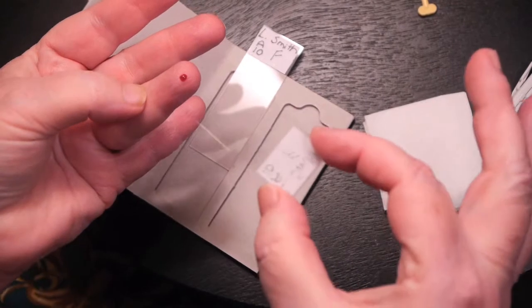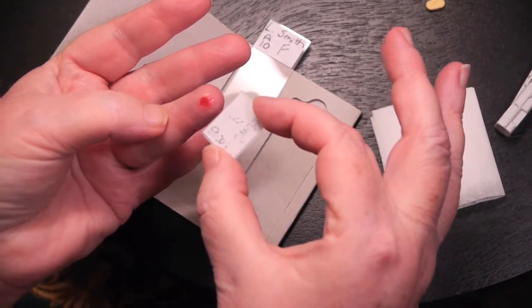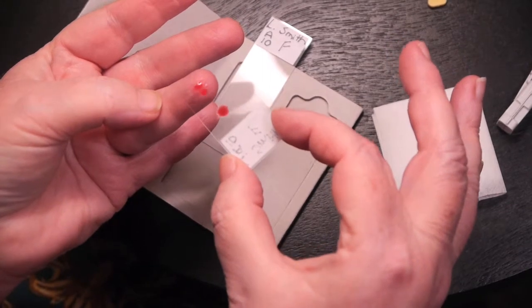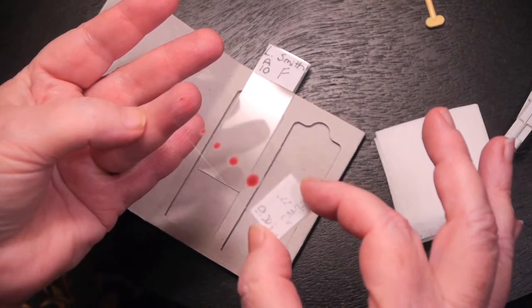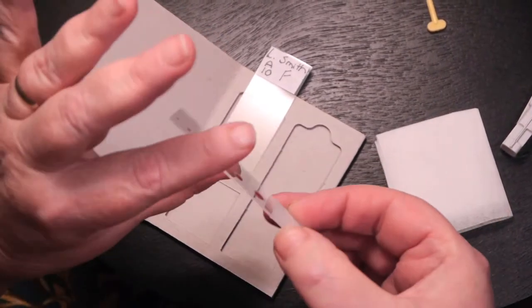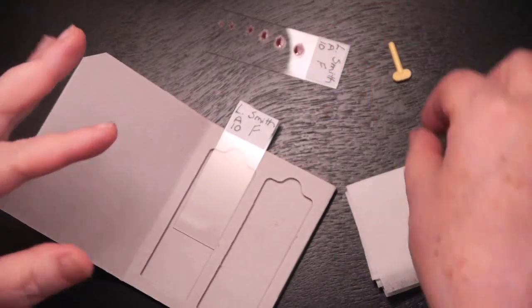Then you'll take the slide face down and gently make some dots along the length of the slide. It's always a good idea to do two samples so you have options and we can compare.